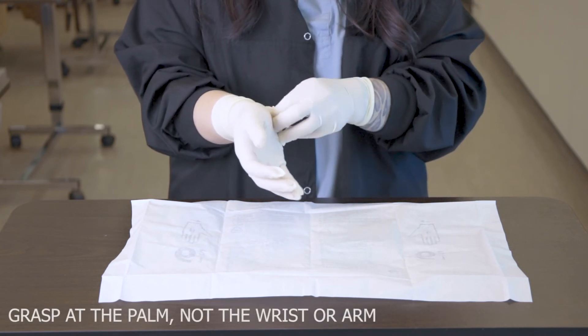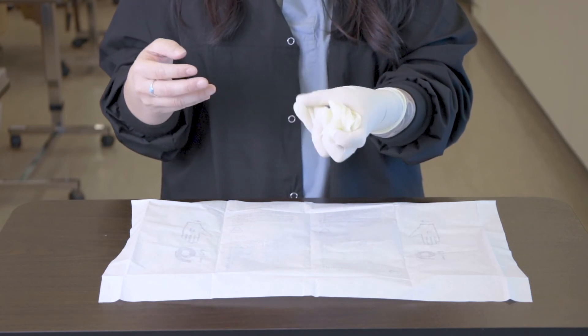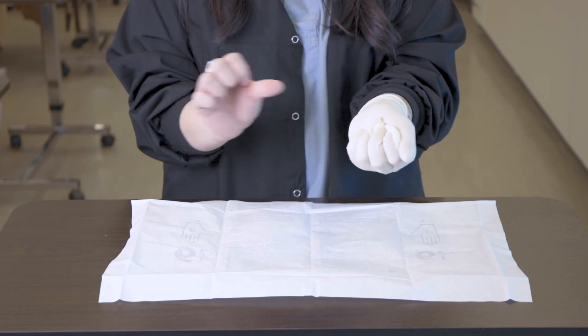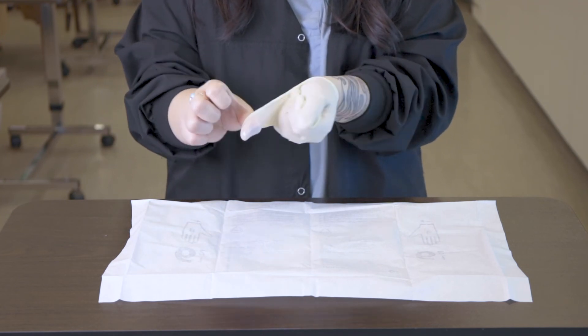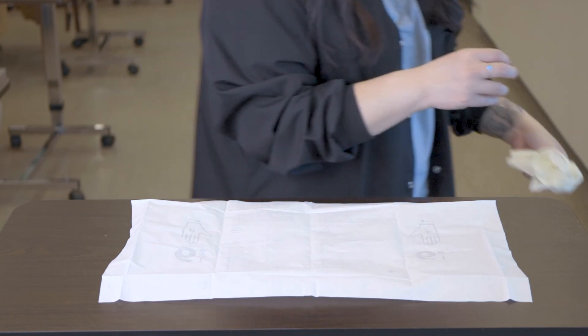To dispose of your gloves, make sure that you're grasping at the palm of your hand and not at the wrist. Crumple up the glove, then remove the other glove by using your thumb and scooping it up at the inner cuff.